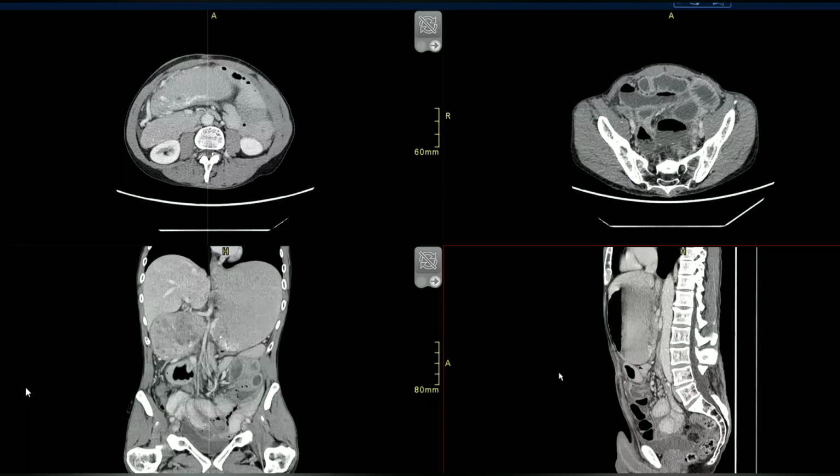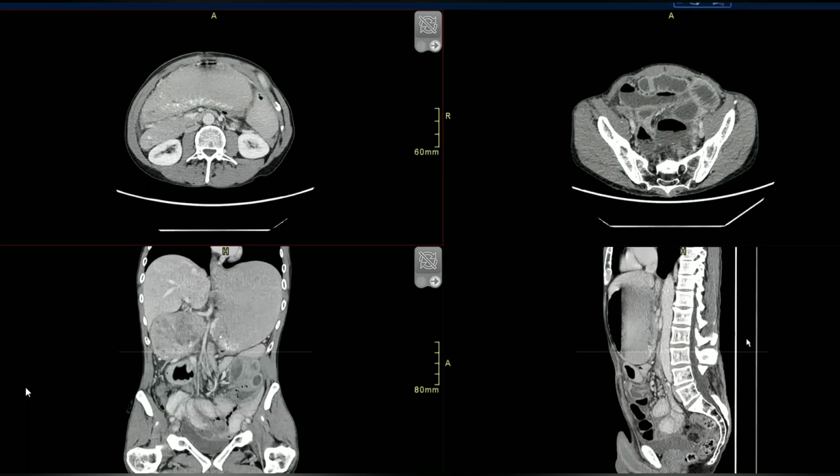So look at her body. See how thin and anorexic she is. There's hardly any fat, so that's why we're having difficulty in seeing also. So this was an SMA syndrome. Look at the SMA. Do you see it like this? Look at the angulation. Yes, the angle is reduced. She has severe weight loss, and then you see that the SMA is literally as if it's compressing. You can hardly make out the normal angulation that we see with the SMA. So there are many causes of this.